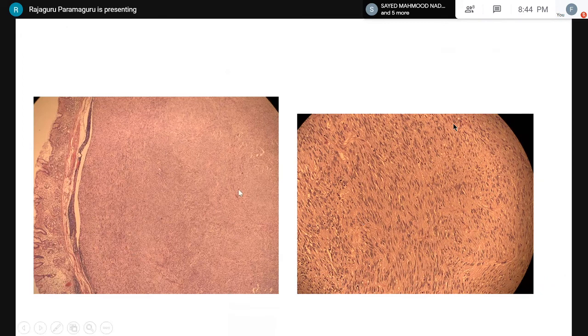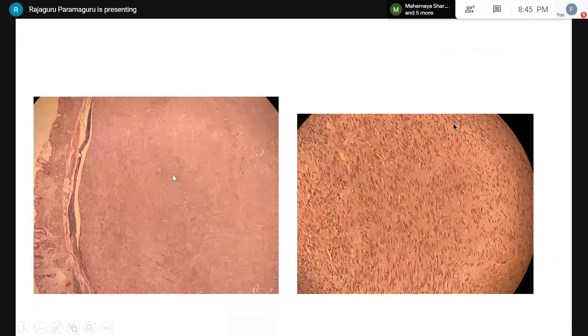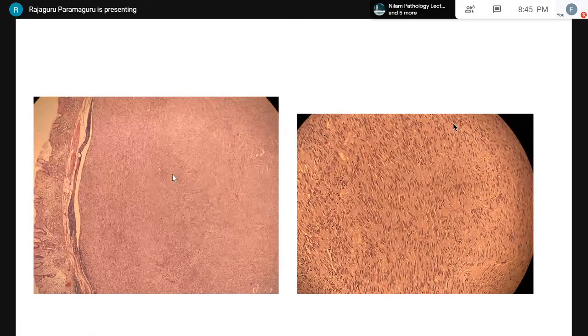We are not talking about the GIT in this case. It just happened to be an interesting case and presented as a polyp endoscopically. I think the doctor who presented the mesenchymal lesion would have covered this. But as we all know, the most common submucosal lesion in the stomach is the GIST, basically a spindle cell lesion.